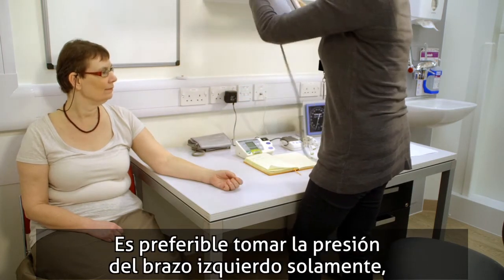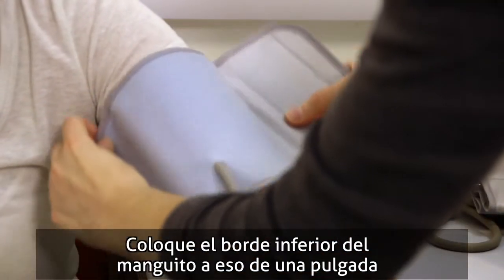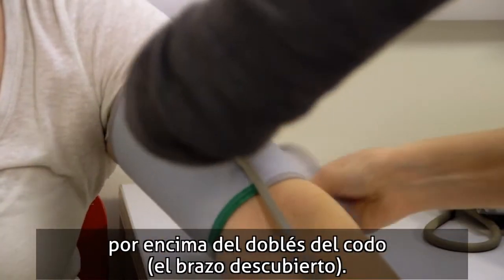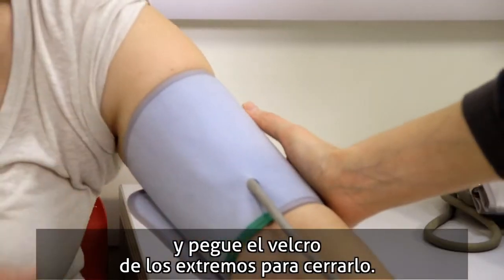Preferably measurements will be taken from the left arm only, but the right arm is also acceptable. Leaving the cuff's lower edge about an inch above the bend of the elbow, place the cuff over their bare arm, close the cuff around the arm, and then stick the velcro together at the ends of the cuff.